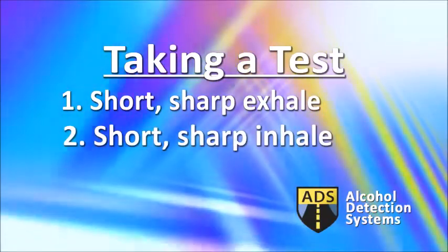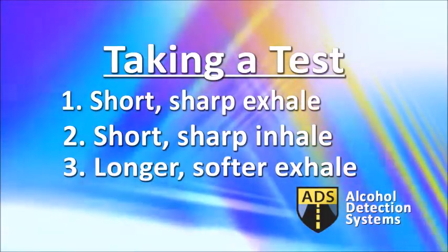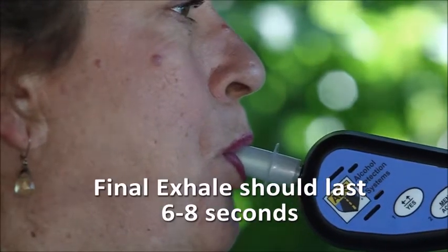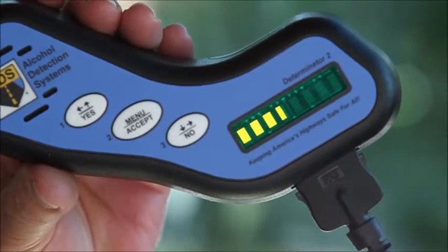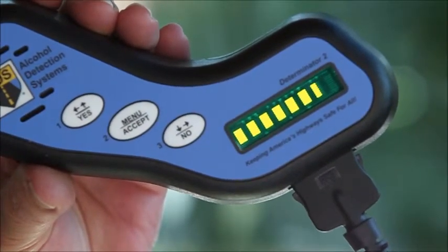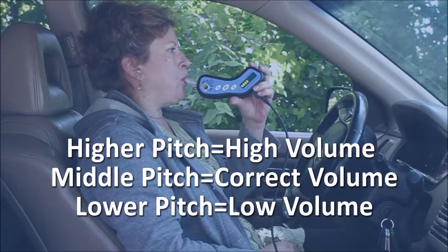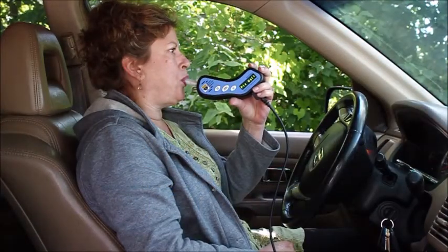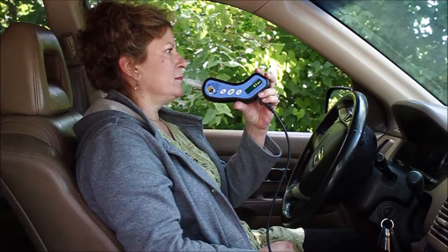Next, provide an equally short and sharp inhale, again causing the device to beep. Lastly, provide a longer and a bit softer exhale, lasting 6 to 8 seconds. The entire time this second exhale is being provided, the device will make an audible beeping sound. The tone of the beeping will increase or decrease based on the volume of air being introduced. Once the device has stopped beeping, you can stop providing the sample and the device will then give the results.